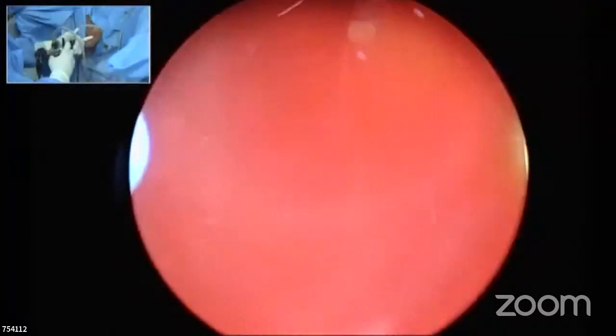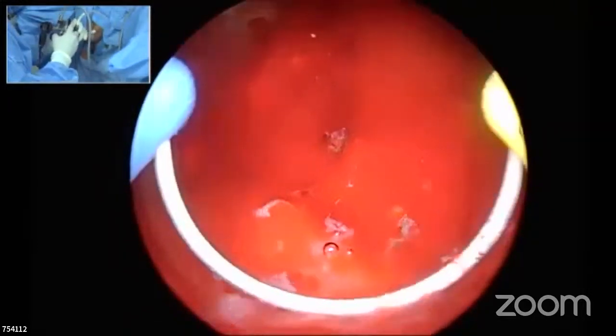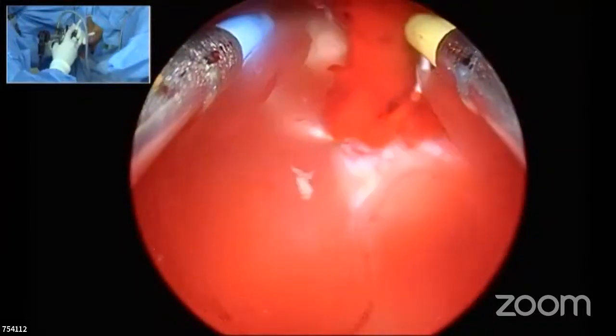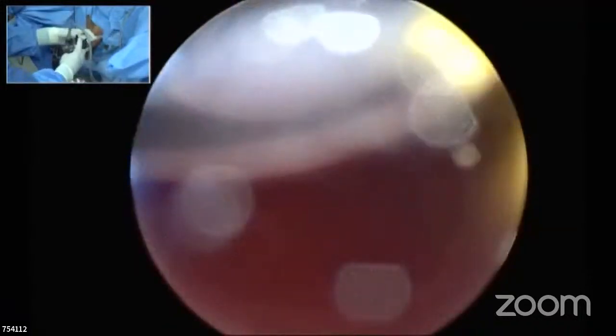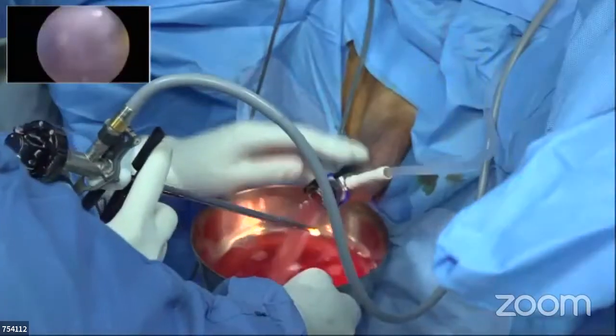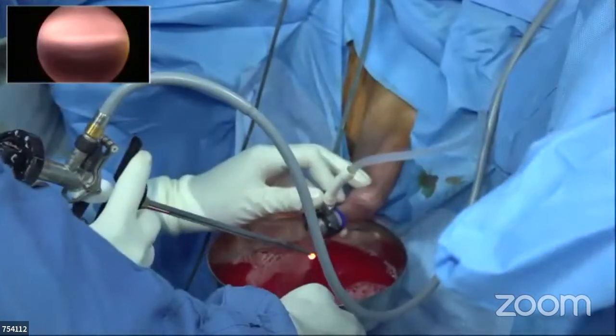There are people who use 24 French intermittent, but they put in a suprapubic catheter for irrigation. Yeah, that is also routine. Sir, somehow I don't like it, because that suprapubic catheter starts leaking around the catheter, and retropubic extravasation can happen. I don't think that is so.